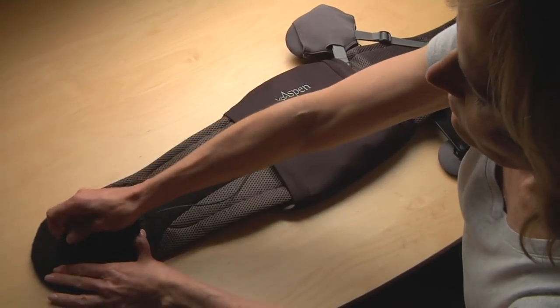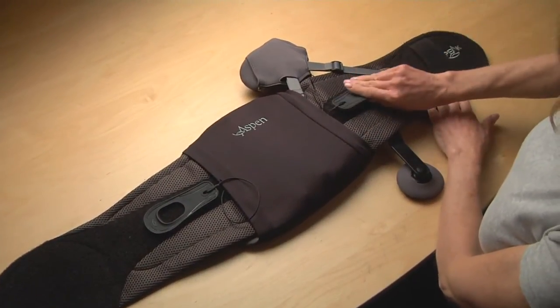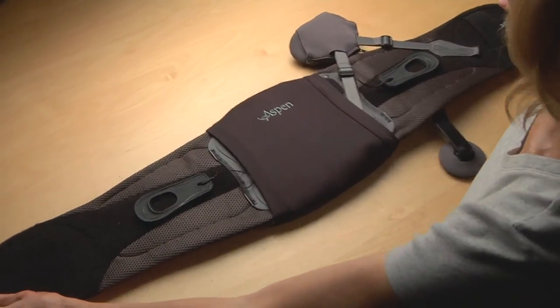To apply your brace, first ensure that the pull tabs are as close to the back of the brace as possible so that the brace can be fully extended.